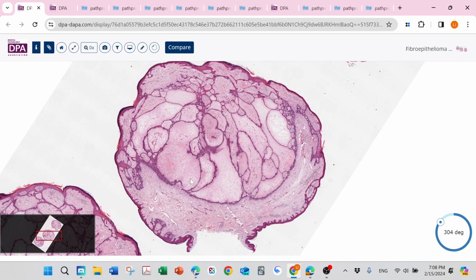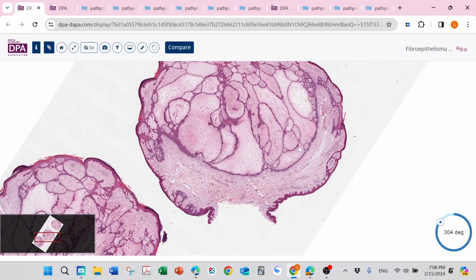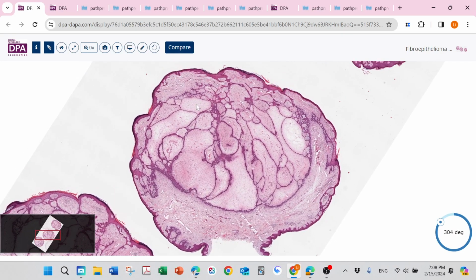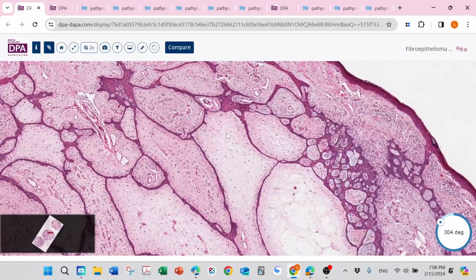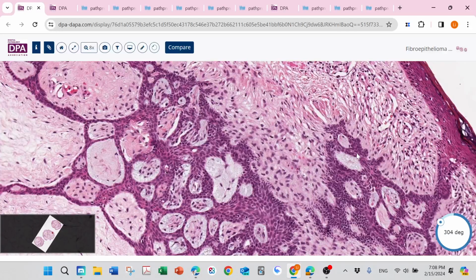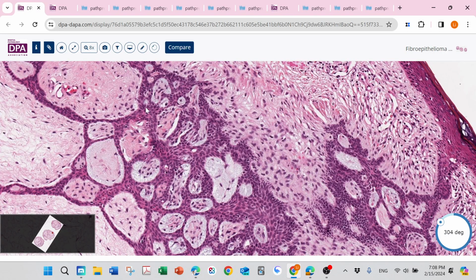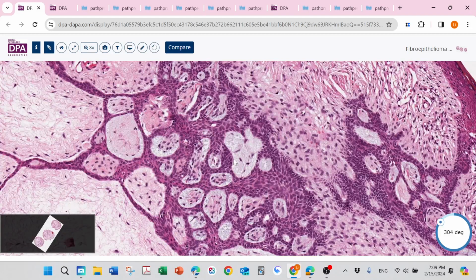And they do not have the classic basal cell carcinoma stroma, not really bluish mucin. But when we zoom in, we can see this basaloid palisading cell. They're not forming nests, they're just forming this strange anastomosing structure, and then some mucin inside this area.